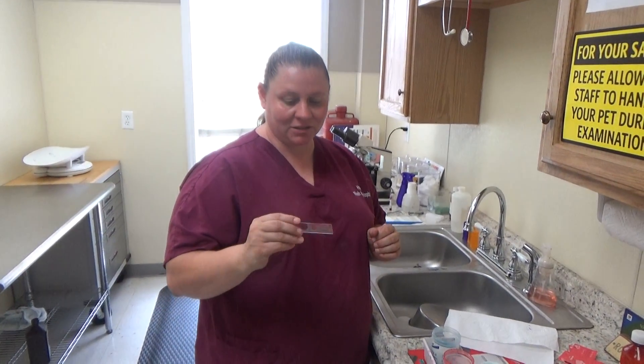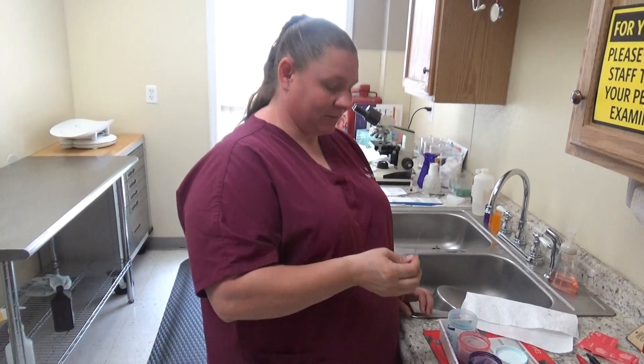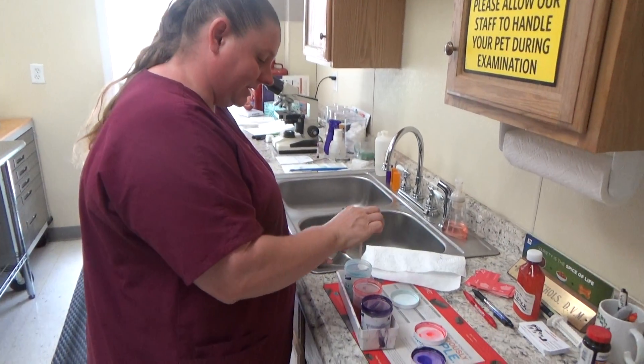I'm back with my dry blood, so now I'm going to stain it with Diff-Quik. I'm going to quickly dip this ten times each.